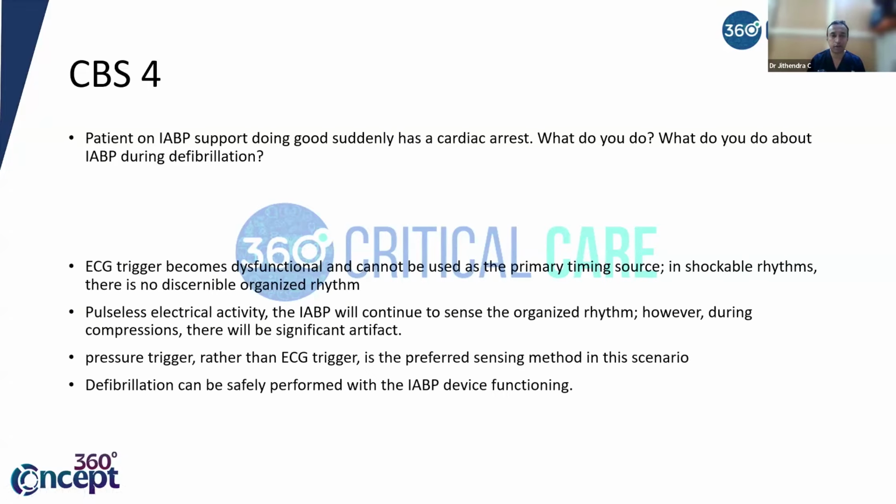So the ECG trigger becomes dysfunctional. I told you there is no waveform coming, so it will become dysfunctional. So change it to pressure trigger or put it to auto mode. So defibrillation can be safely performed with the IABP device functioning. No need to stop or change anything on the IABP. You can completely go ahead with your defibrillation as you do it routinely.